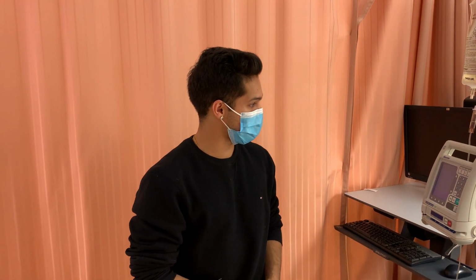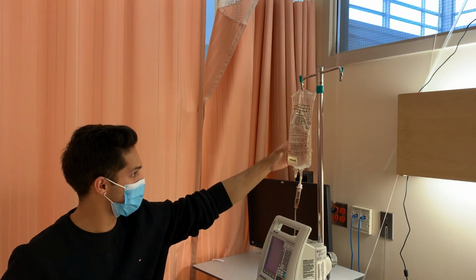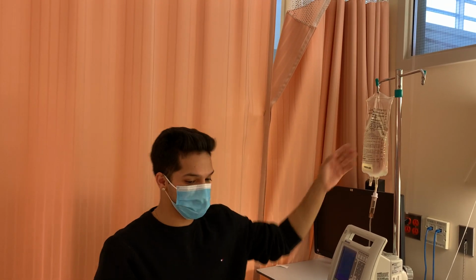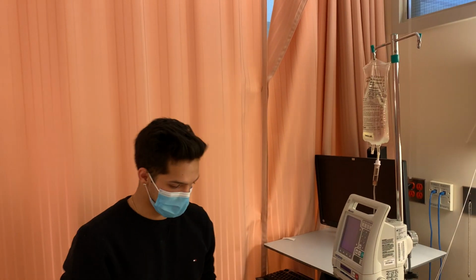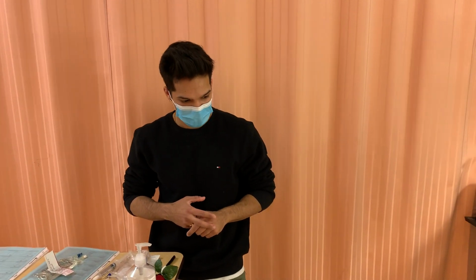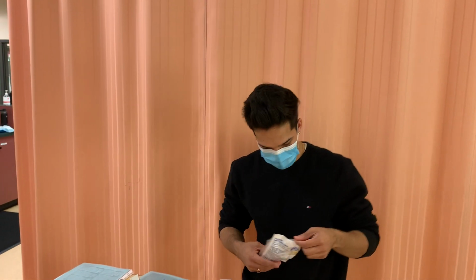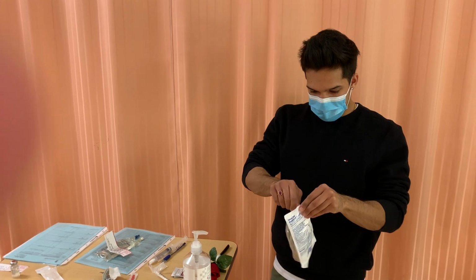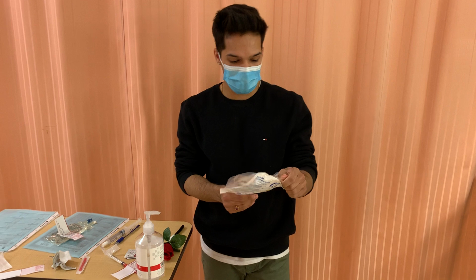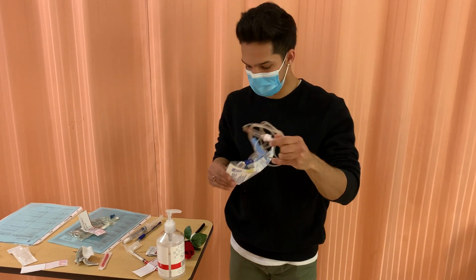Once they've given me consent, I'm just going to be looking at the pump. As I can see, there's a primary TKVO of normal saline running, which is compatible with my medication, and that's good. Then I'm going to be priming my tubing. Before giving this medication, I'll be doing a set of vitals as well. Here I have my continuous portless tubing, which I'm going to be using so other people don't try to add any medications onto this line, and I'll also be labeling this line.